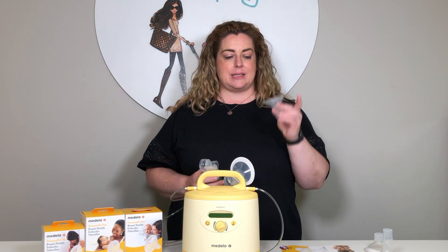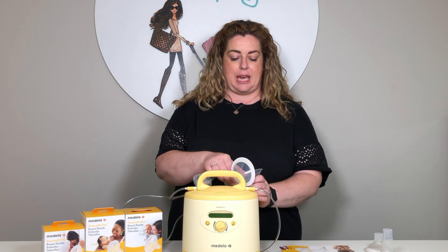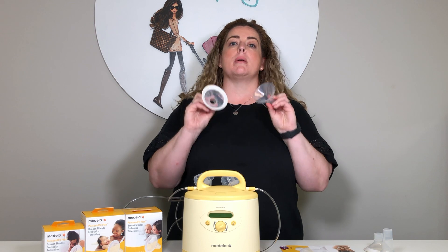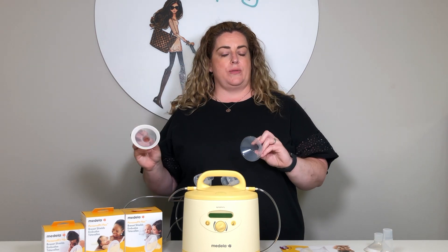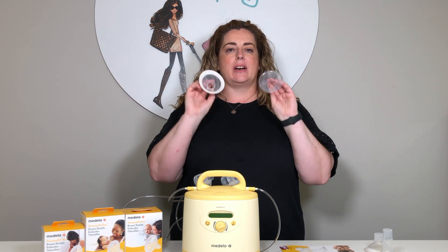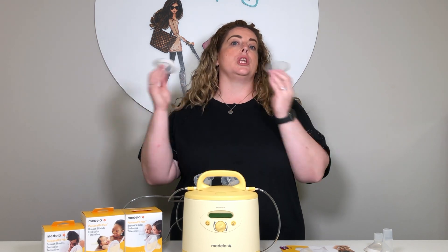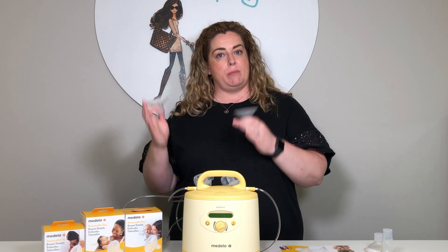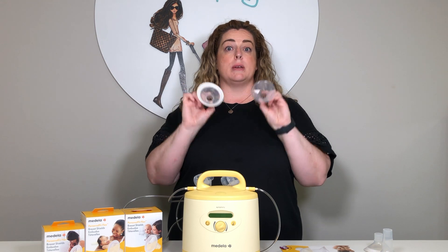So this is a breast shield. More recently, Medela came out with what they call a flex shield. The reason I'm talking about Medela today is because in another video we'll cover the Ameda pumps and Ameda breast shields — they are an entirely different range and do not interchange with the Medela ones. So if you're looking for information on an Ameda pump with Ameda breast shields, come back to that separate video. This is all about the Medela ones.